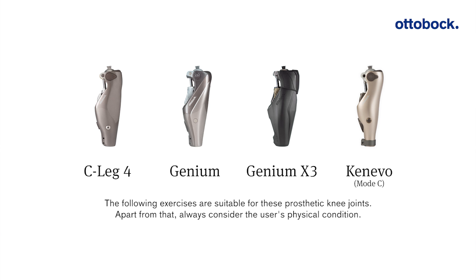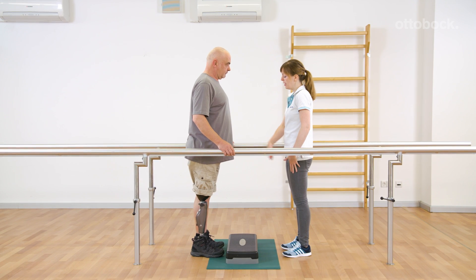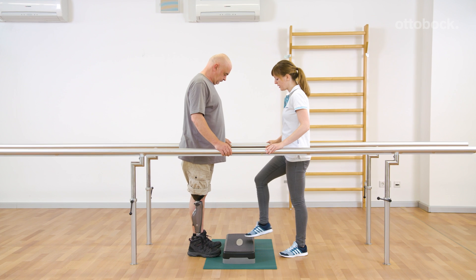The following exercises are suitable for these prosthetic knee joints. Always consider the user's physical condition. Franziska and Gerhard show a few simple but effective exercises to improve stance phase.